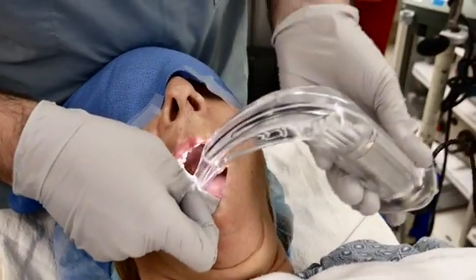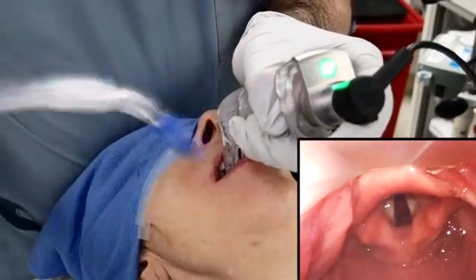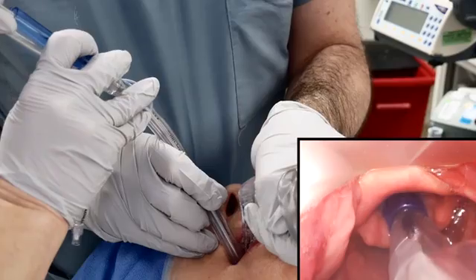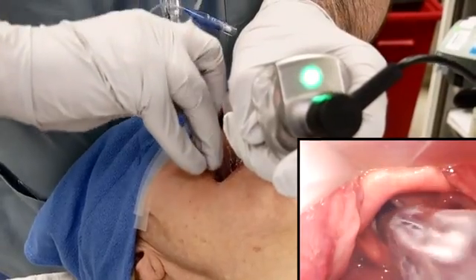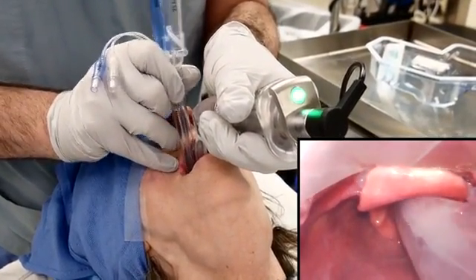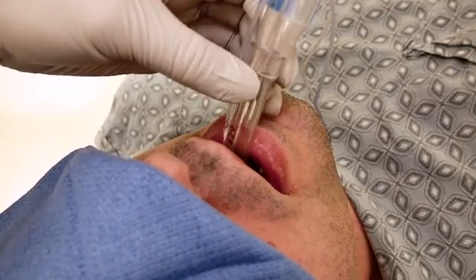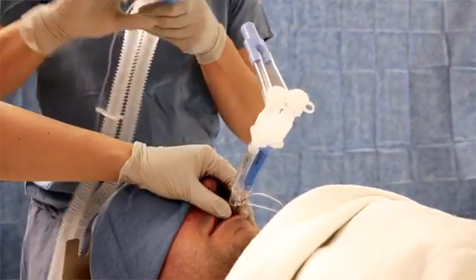Perform direct laryngoscopy to visualize the glottis. Advance the double-lumen endotracheal tube until the bronchial cuff passes the vocal cords, taking care to avoid touching the tube to the patient's teeth, which could damage the tracheal cuff. Remove the stylet. Rotate the tube 90 degrees to the left or counterclockwise for placement of a left-sided tube, and 90 degrees to the right or clockwise for placement of a right-sided tube. Guide the tracheal cuff past the glottis, typically advancing the tube to 27 cm from the incisors in women and 29 cm from the incisors in men. Do not advance against resistance.